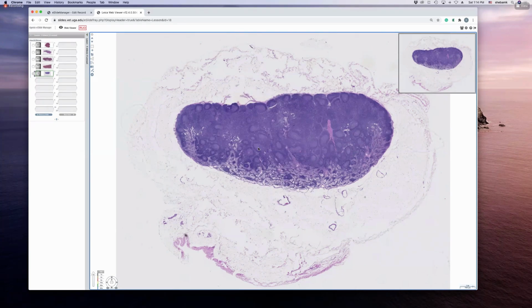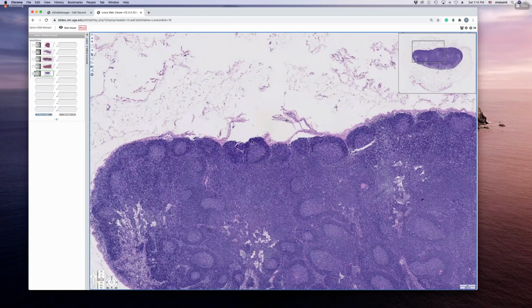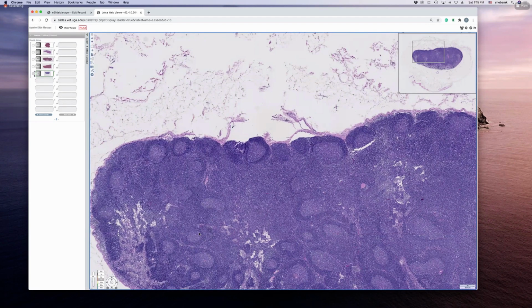These are lymphatic nodules. Wherever you see lymphatic tissue, you will see these nodules, except for the thymus. All other lymphatic tissue will have these nodules. A typical nodule has parts. Let's go closer to the cortical region. Let's say that this is a nodule. Here is a nodule, there's a nodule, there's a nodule.